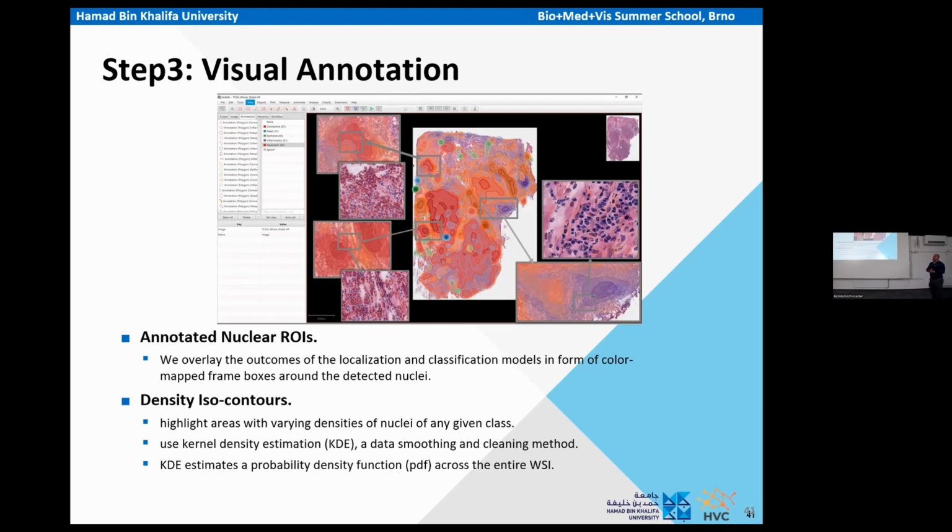a high level can give the pathologist a way to distinguish the most important features, and especially to try to figure out immediately the areas in which there is a sort of contraposition between the neoplastic tissue and the inflammatory tissue and so on. In the first qualitative sessions with the pathologist, he was particularly impressed by the fact that he was immediately able to find the areas where there is inflammation reacting to the neoplastic tissue. So we realized that we are probably on a good path for providing something that can be of interest for pathologists.